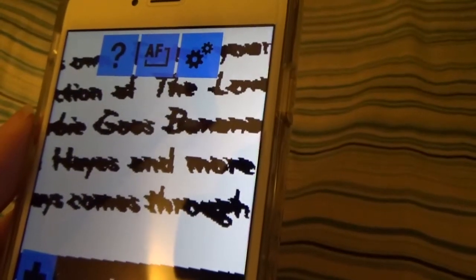Increase zoom. Now, obviously it looks a little bit blurry. But you can also, again, I am away from the image, and I can just pan around, and I can save it to photo gallery. It's really very, very nice. And how much is this software? Well, if you can believe it, only $4.